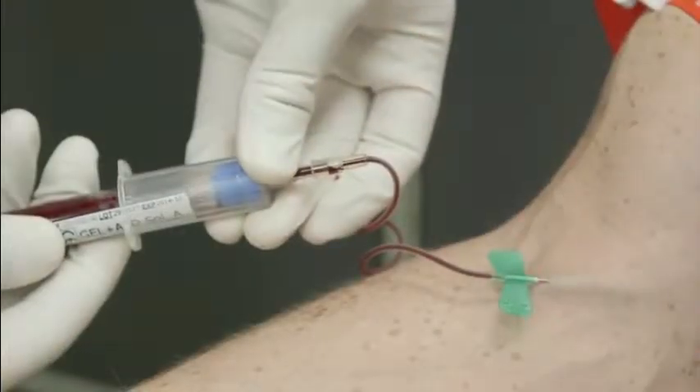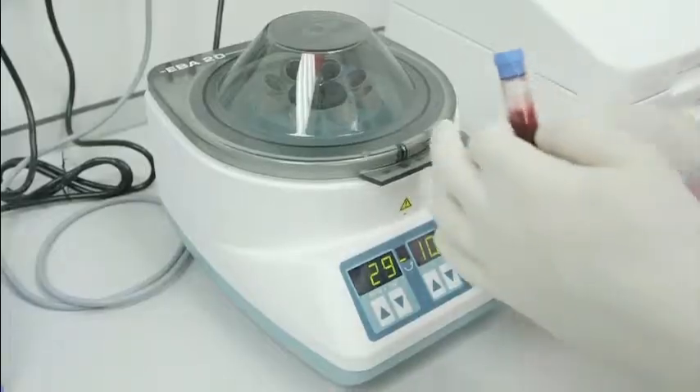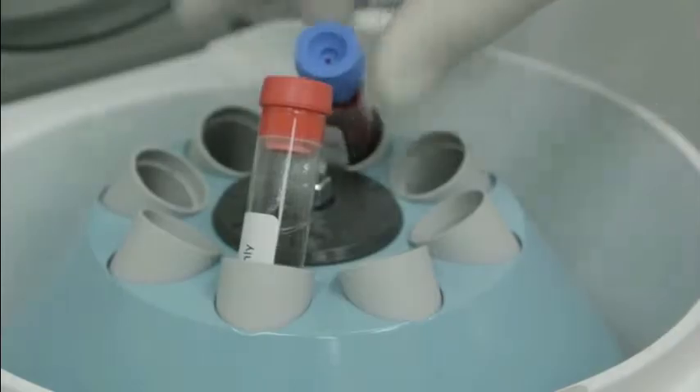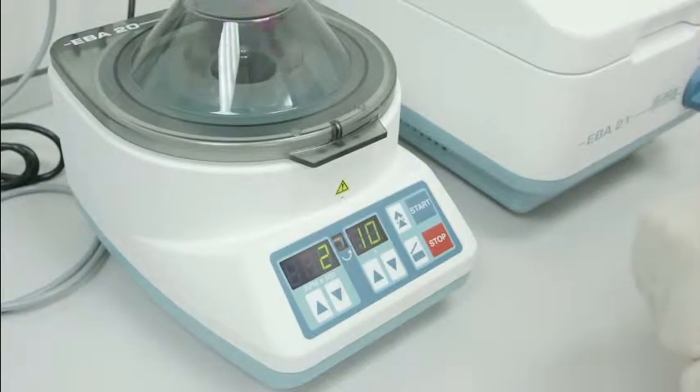Your doctor will then remove 10 milliliters of venous blood which is stored in a specially designed blood container. This is placed in the centrifuge and spun at 1500 Gs for 10 minutes, which allows separation of the various blood products.